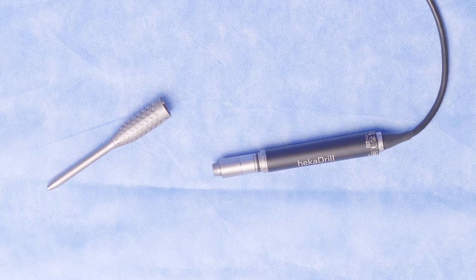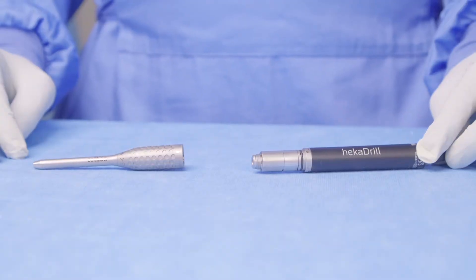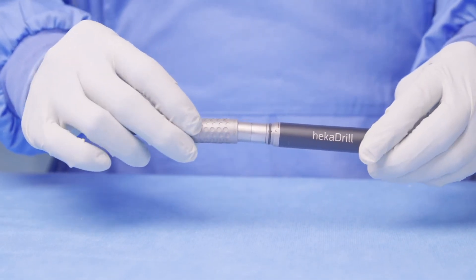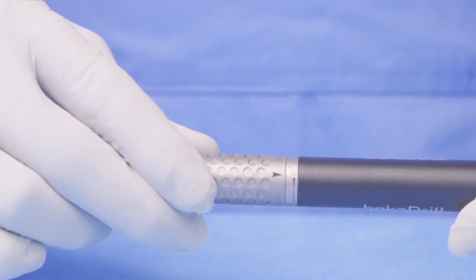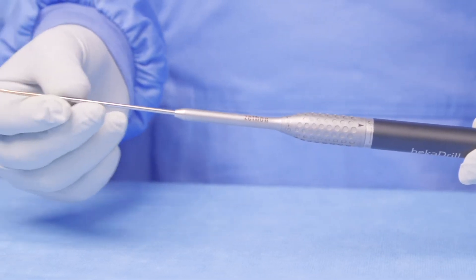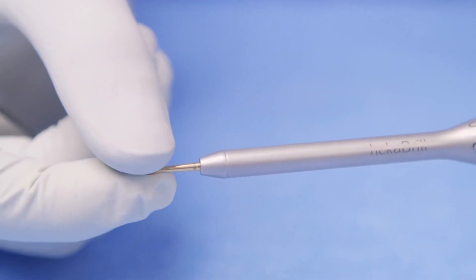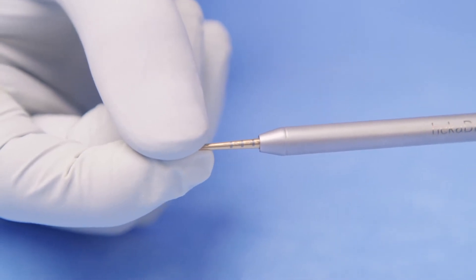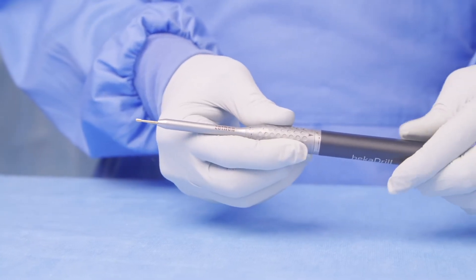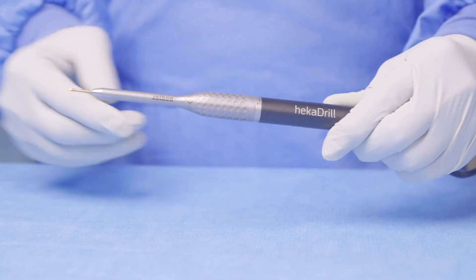Now let's take a look at the range of attachments available for the Heka Drill system and how to connect them and their cutting accessories. Firstly, we'll start with a straight burr. To connect the straight burr, take the attachment and slide it over the handpiece into the unlocked position. Once in this position, you can take your cutting accessory — in this case a burr — and slide it through the nose of the attachment. The Heka Drill burrs can be adjusted in 2.5mm increments. Once fully in, you can twist the attachment from the unlocked position to the locked position. The burr is now securely in place.